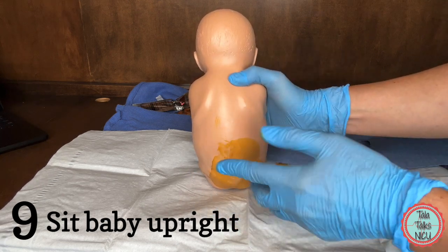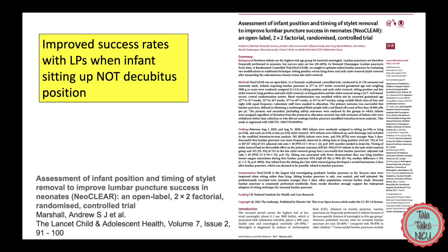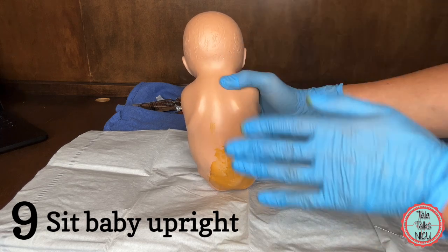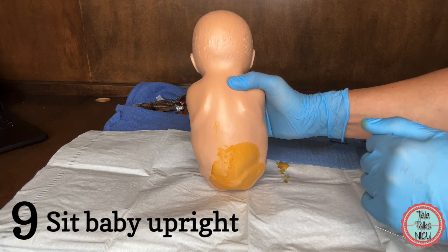You're not going too lateral, and it has been shown to decrease the rate of missed taps. One study in patients above 27 weeks showed this position is superior to the decubitus. But just remember that in the tiny babies it hasn't really been proven one way or the other.